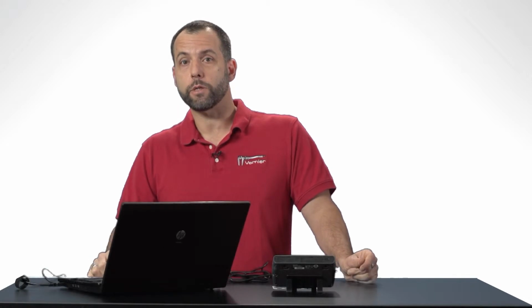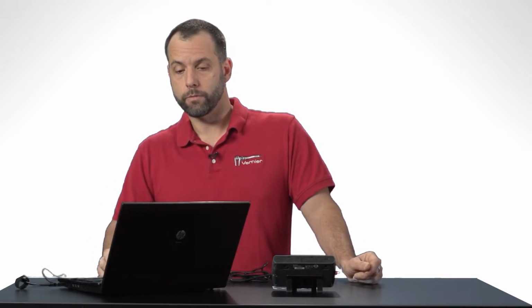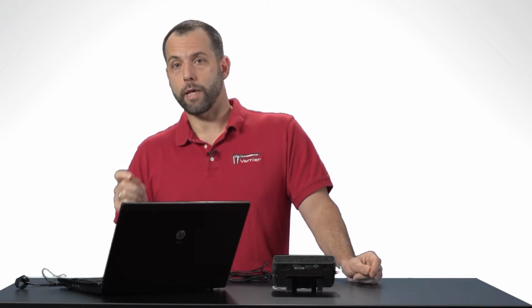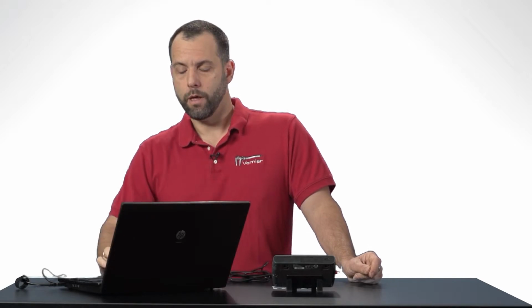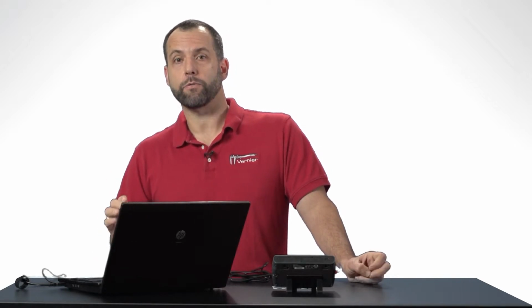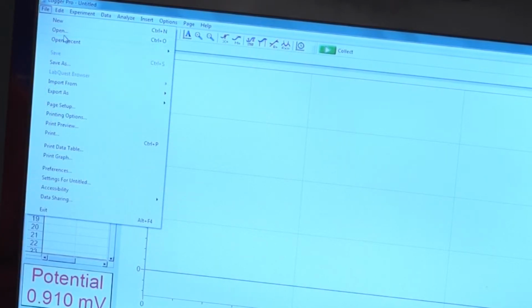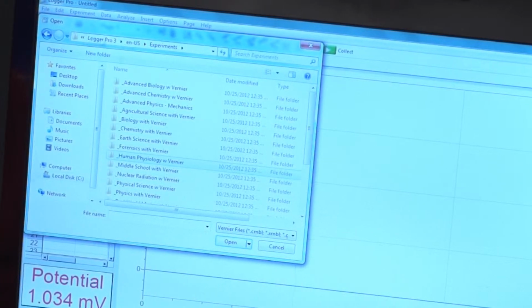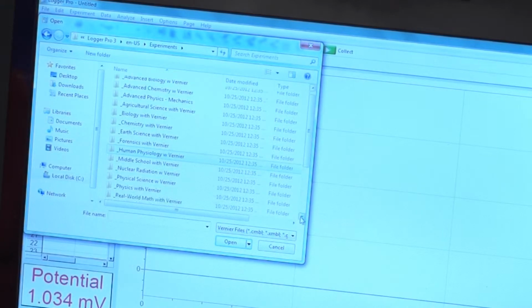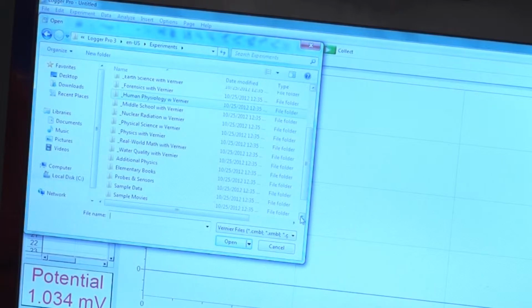But there's a couple things you need to know about if you're going to use digital filtering with an EKG trace. Those key things are you need to sample a little bit faster and you need to open up a special file. And that file is located in a special folder. So if you go to File, Open, and if you go to the Experiments folder here once again, just scroll down until you get to the folder called Probes and Sensors.